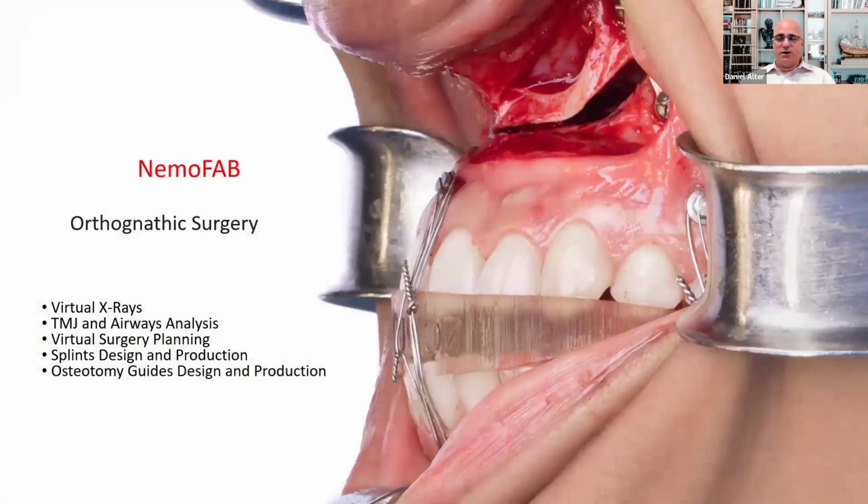So that leads me to the last segment, which is the Nemofab. And I think there's another set of questions that will be coming up soon. But thank you, if you would be so kind as to answer.